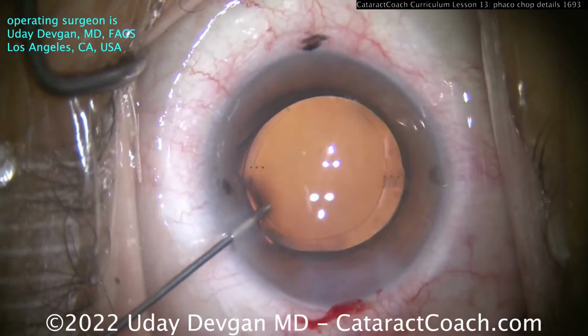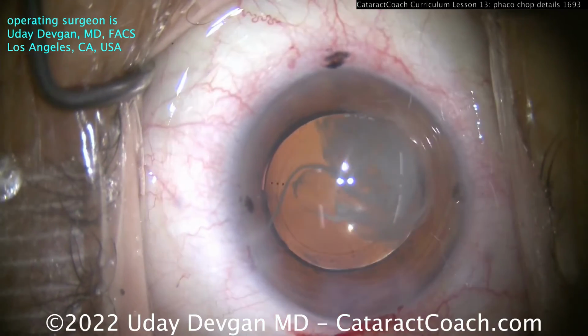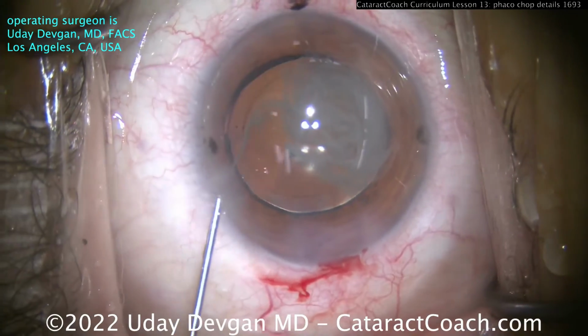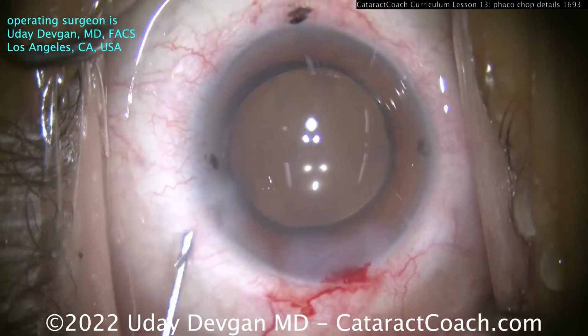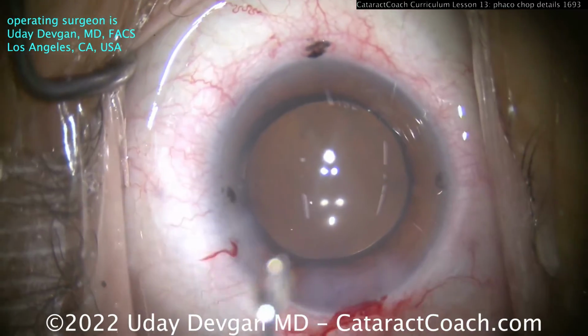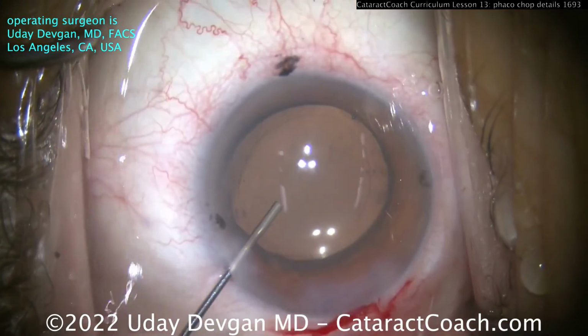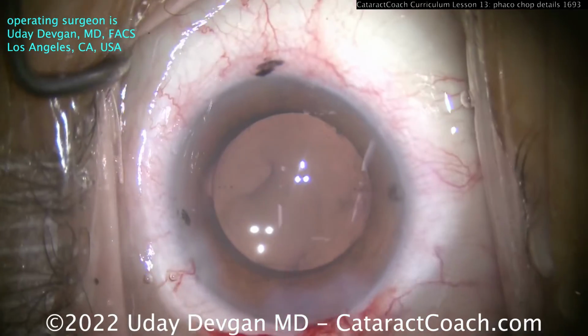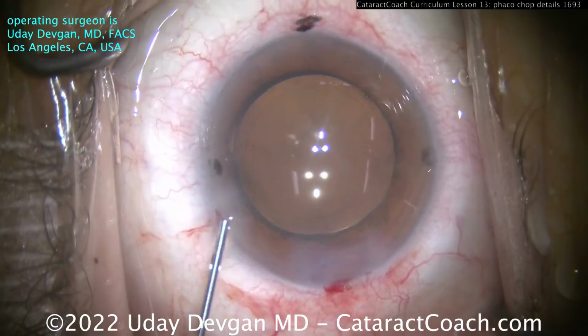The end of the case here, how about some triamcinolone? That's about 0.5 to 1 milligram preservative-free. And then we'll put some moxifloxacin as well in the anterior chamber. That's preservative-free for endophthalmitis prevention. And then finally some balanced salt solution, get the pressure where we want it, and we can check that and everything looks great.